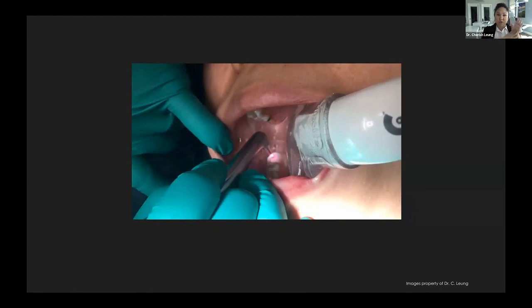So what I do first is I show them on their hand. I let them know, hey, this is going to sound like popcorn popping, but it doesn't smell like popcorn, which is too bad because popcorn smells so good. And then they laugh and they're happy. Then I let them know it's just going to feel like this. See, it doesn't hurt. It's just really loud. We have noise-blocking headphones with a movie playing, so they don't even care. But it's important for you and the parent to know that it's going to sound like that, and it's fine.